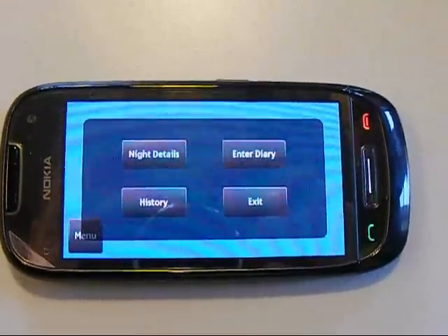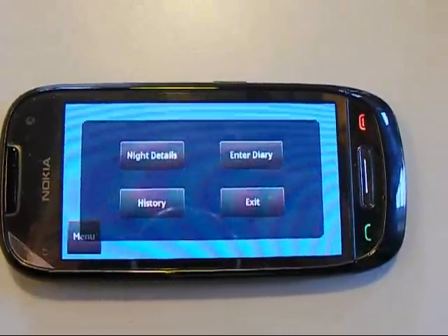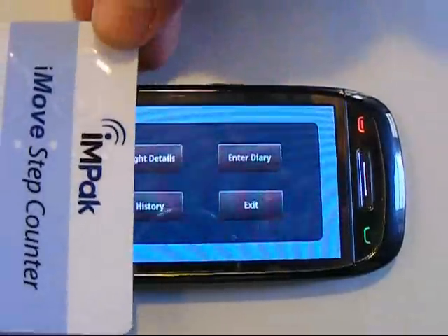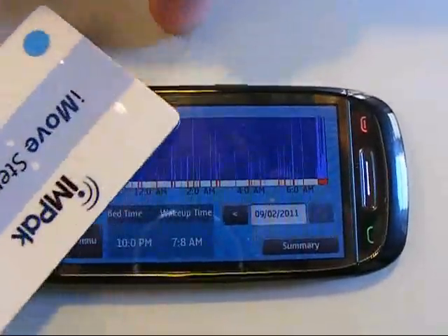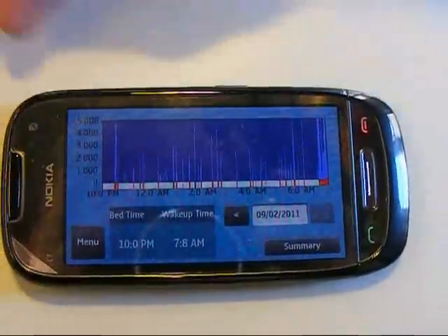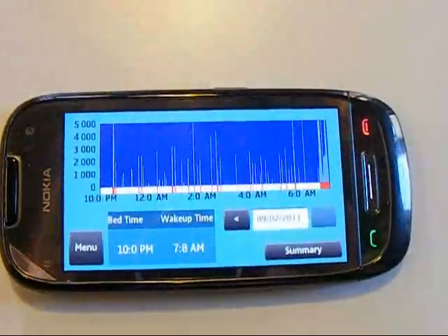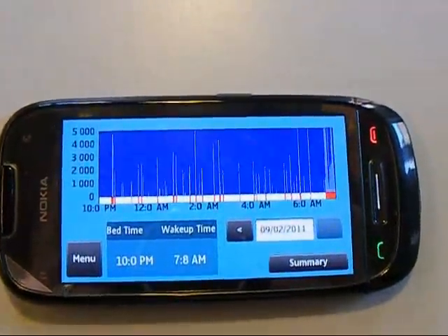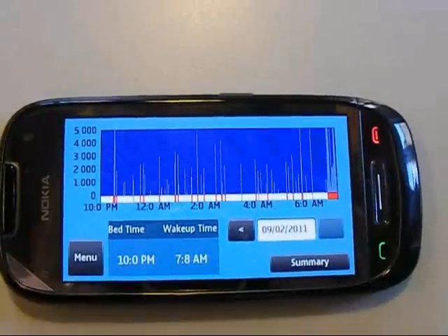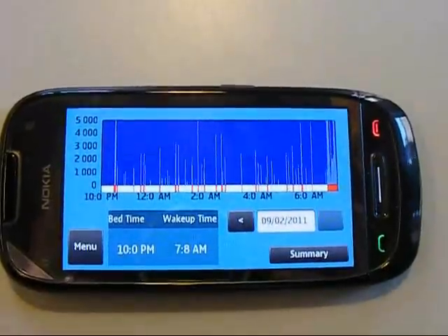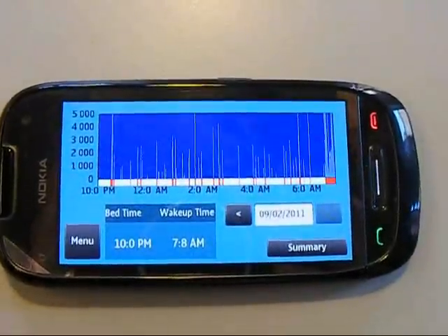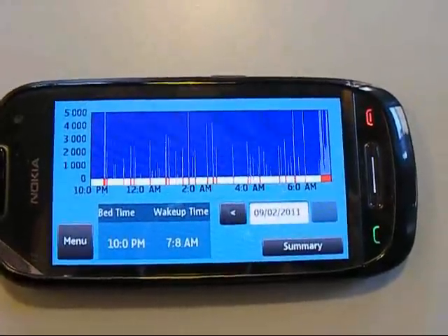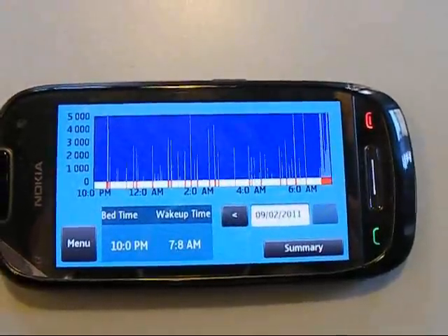So this is the sleep application. I put the sleep card on the phone and it reads the data. It will then take you to a view where you can see an actigraph of your last night's sleep.